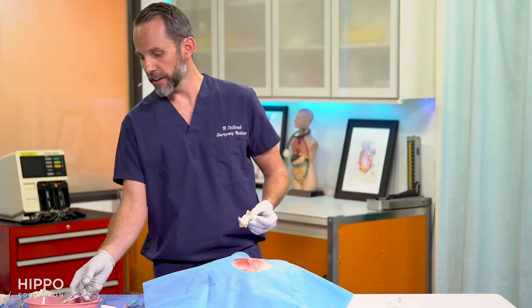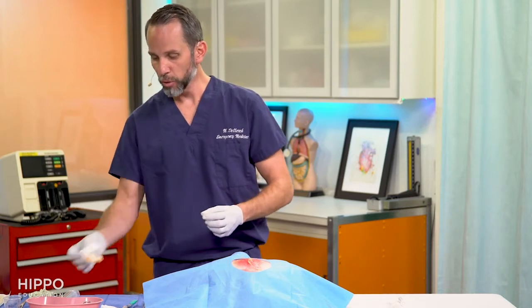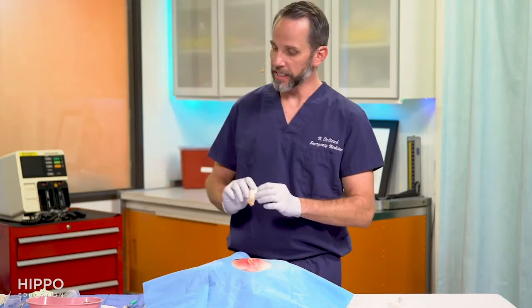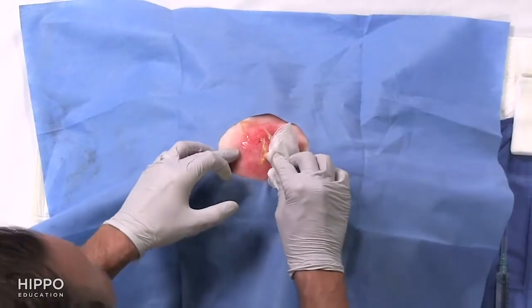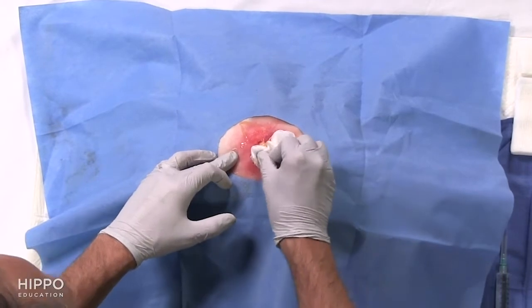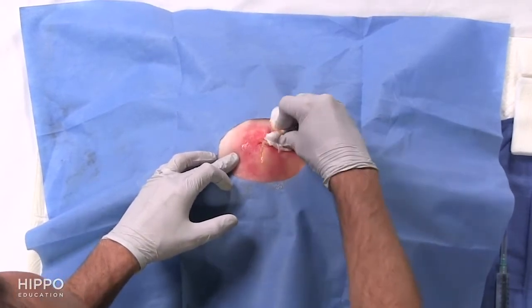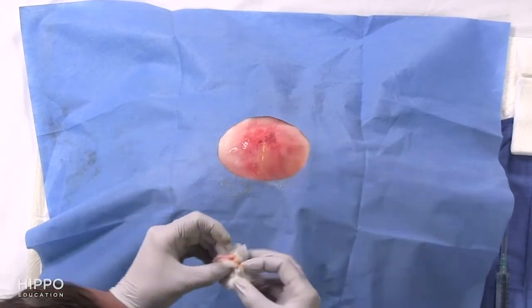I like to keep a little area where I have my dirty tools so that I kind of know where they are and I can keep them contained in one area. I'll put all my used 4x4s in that spot as well. Milking the abscess is not really necessary. It often causes a lot of pain, but if you are having some areas you want to see how much pus is left, giving a little bit of pressure on the outside is going to be okay.